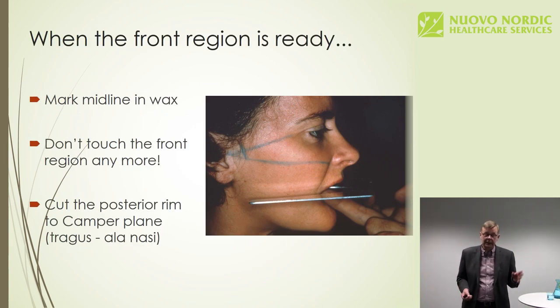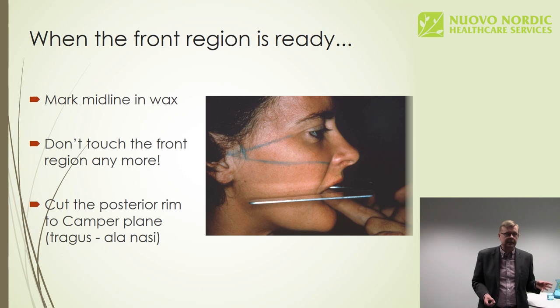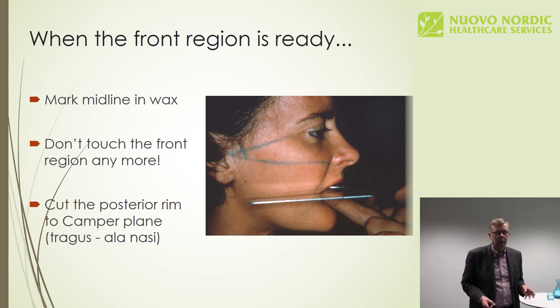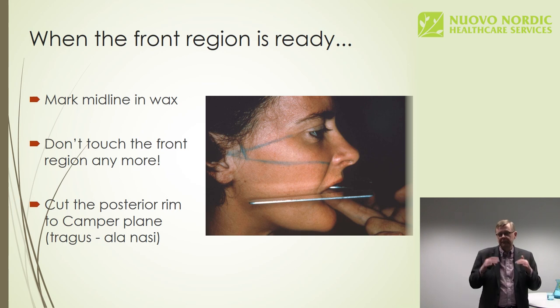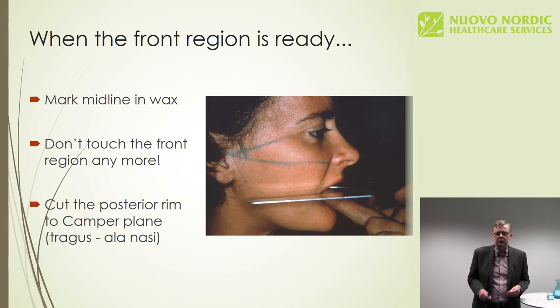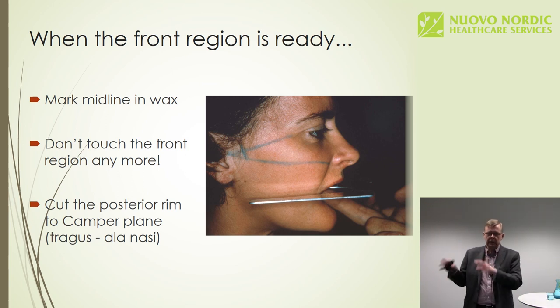Yes, and by the way, if the patient has an old denture, you can always ask about the good qualities of the old denture, about the visibility, etc. If the patient wants to have them copied to the new denture, it's always useful. When the front region is ready, don't touch it anymore.